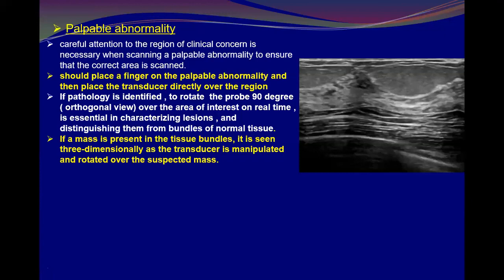But we have to rotate the transducer and make sure this area of the parenchyma is purely clear parenchyma, nothing else. We have to follow the rule, not just put the transducer down because this is a palpable abnormality. If you put your finger on it, you expect the size of the palpable abnormality to be very small. But the palpable abnormality was a little bit larger.